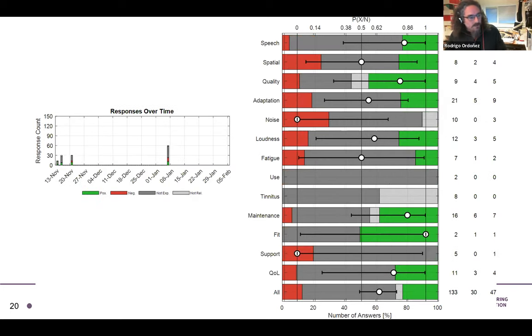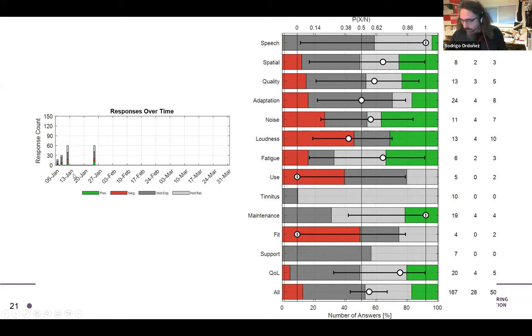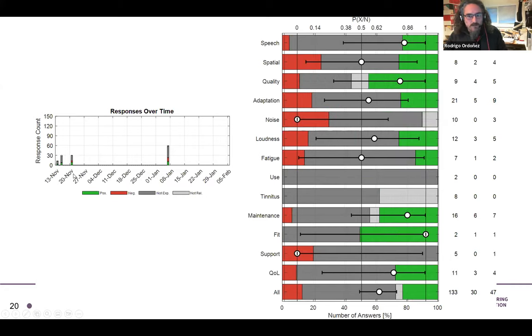On the other hand, if we get people that don't engage with the system at all, then it's very hard to say anything about them. We can see that the person maybe used it 3 times during the first 2 weeks, and then once just before the follow-up. This person was probably feeling bad that he was told to do something and didn't do it just before he had to meet the audiologist. See, this is an example of somebody trying to study for a test the day before.